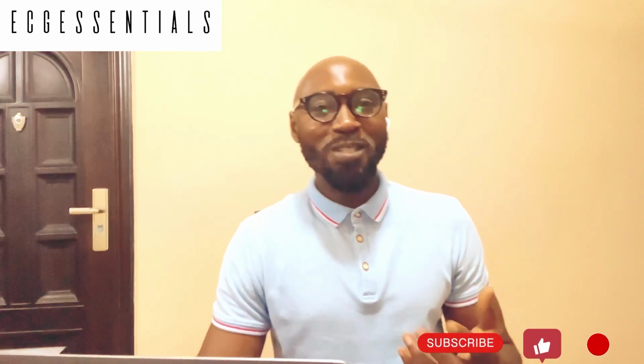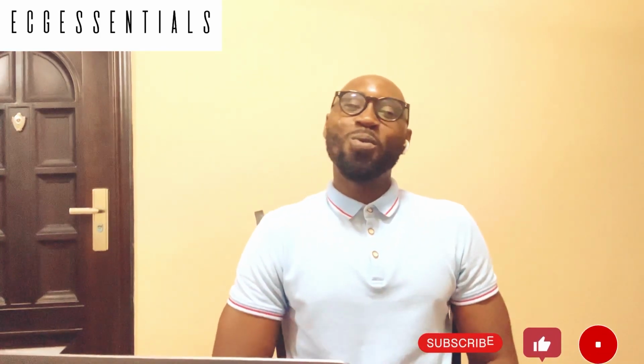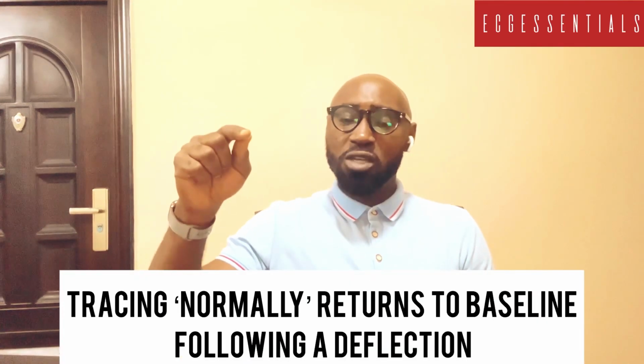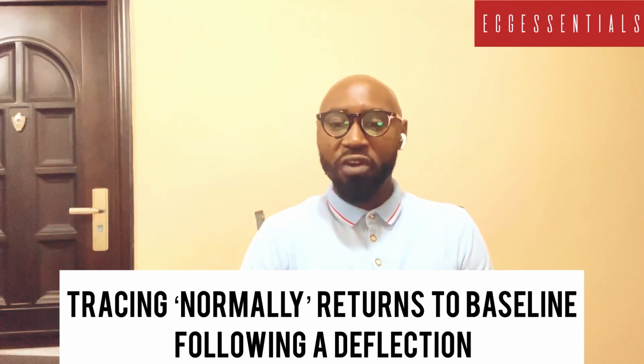Ladies and gentlemen, from these images, we realize that the ECG tracing actually begins with a straight line before we see any other deflection. And that straight line or that baseline is called the isoelectric line. It is about this isoelectric line that we see these deflections that are lettered in alphabetical order. And of course, following the deflection, the tracing normally returns to the isoelectric line.